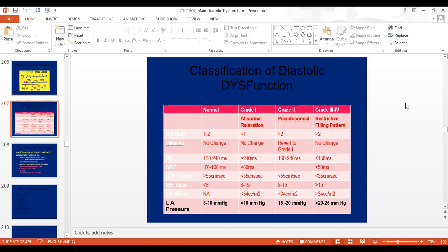Okay, sir. So if you are using, use only the mitral flow pattern. Don't use tissue Doppler for calculating grade 1 to 3 kind of patterns. Once you're looking at tissue Doppler, then you should talk of 2016 onwards parameters. Okay, sir. Right. Thank you.